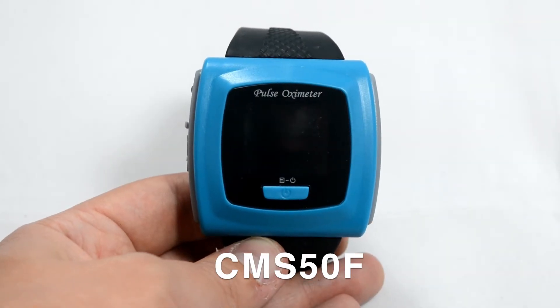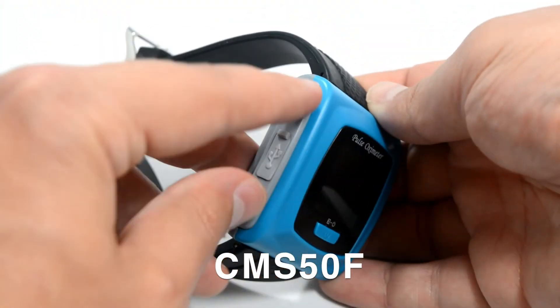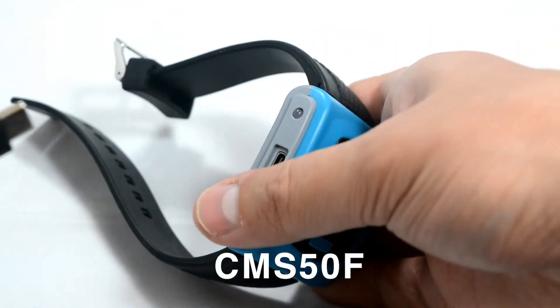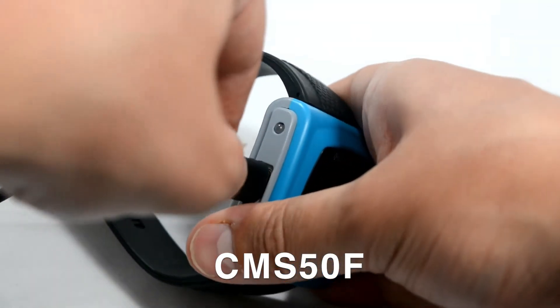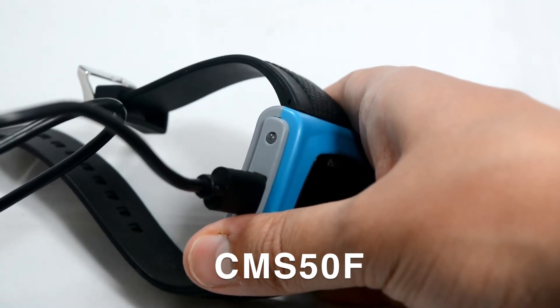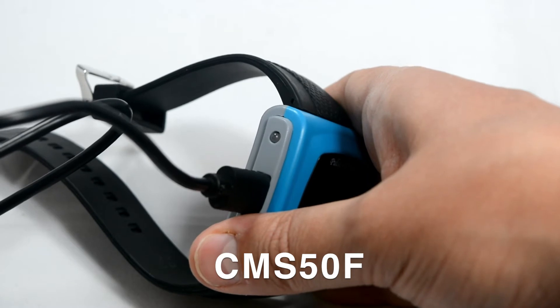The CMS50F is a rechargeable device. To charge the device, you'll notice a plastic flap that will reveal a USB-C port. Using the transfer cable, which is also the charging cable, plug the device in. When plugged in and attached to a power supply, the device will start to charge.